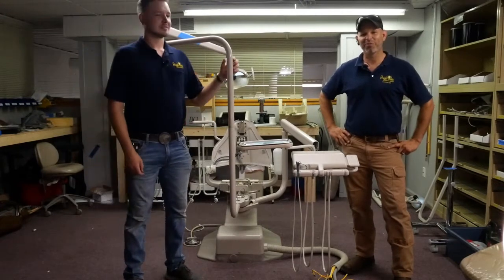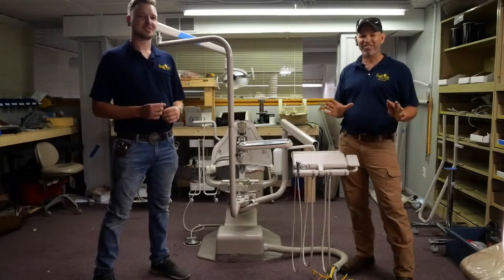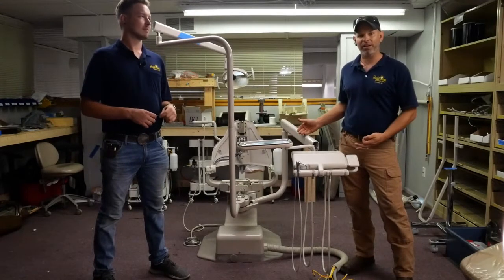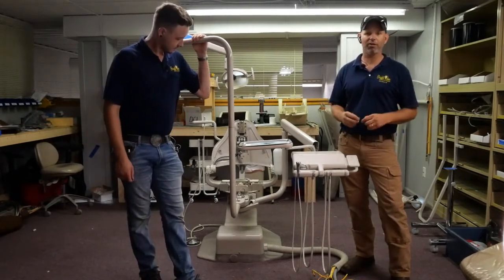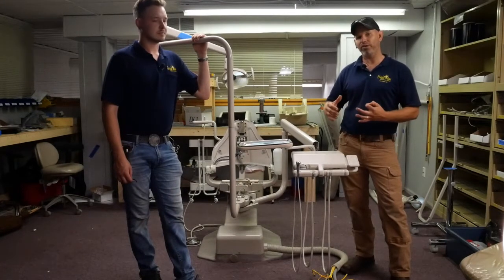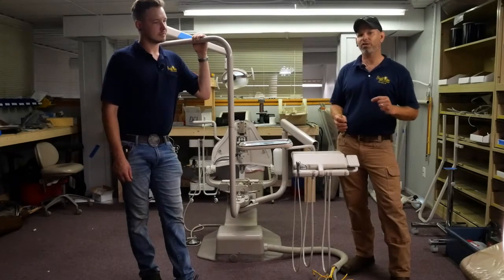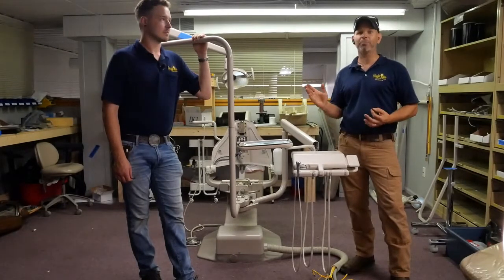Hi, I'm Jason from the Dental Equipment Repair channel. And I'm Calvin. We are here today to train you on adjusting something on your dental chair that may be driving you crazy. These dental chairs, especially hydraulic ones like this Adec 1040 here, have a hydraulic pump and a hydraulic reservoir and all the associated components. And there's a central valve that regulates the flow of oil through the system. With these chairs, there's actually an adjustment that you can do on most hydraulically operated dental chairs to change the speed of things like the base up and down and back up and down.